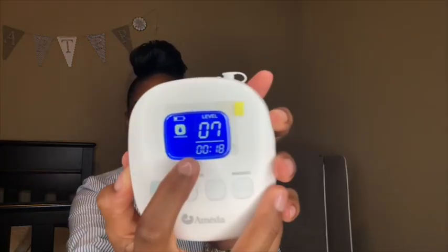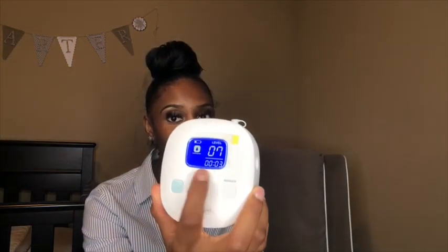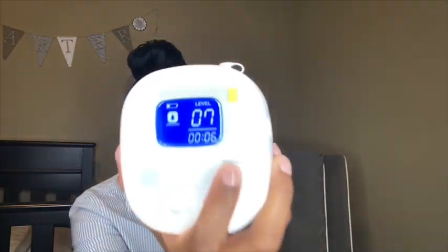The battery really does last. When you turn it on, another thing I like is that it's digital and it goes back to the mode you had it on when you turned it off, which I love because sometimes I forget which mode I had it on. Another thing I love is that it counts the time for you so you can see how long you've been pumping.